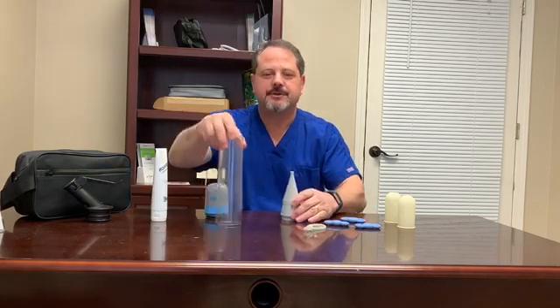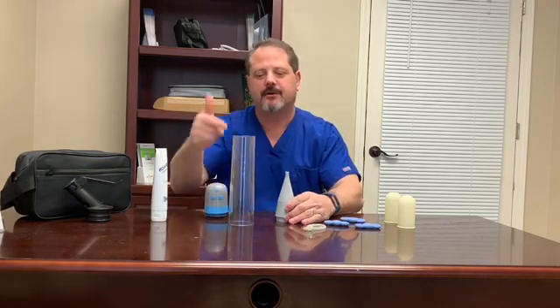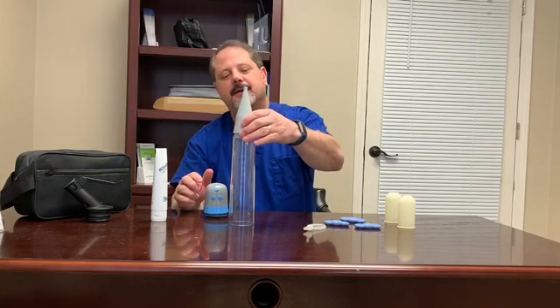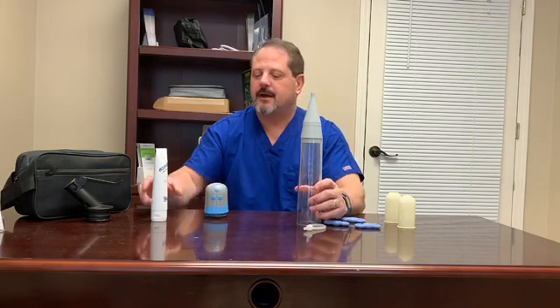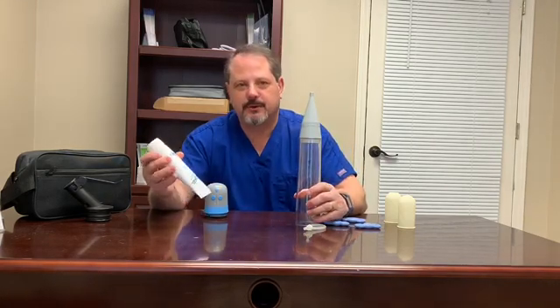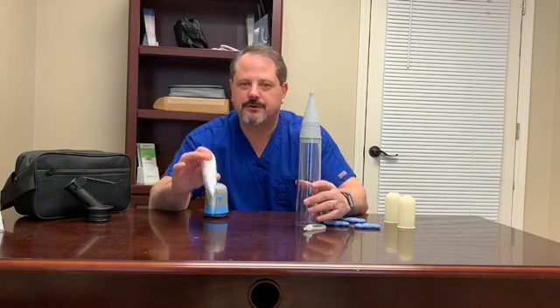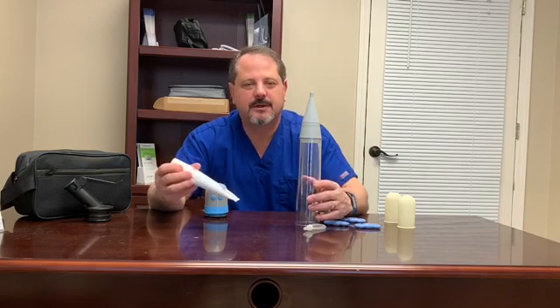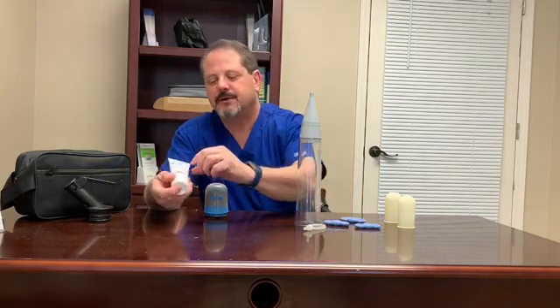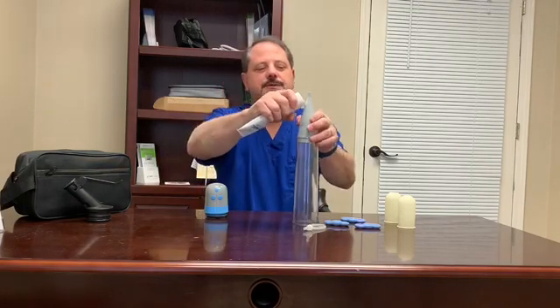The first way you can use it is the traditional way, which involves a loading cone to lubricate and transfer the band onto the cylinder. The band loading cone goes into the end of the cylinder where the penis goes in. You need to use a water-soluble lubricant — make sure it's water-soluble. Don't use oil-based products, Vaseline, or anything grease-type. It will usually say 'water-soluble lubricant' on the tube.